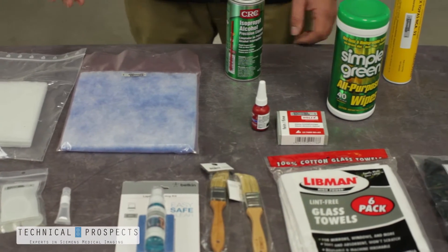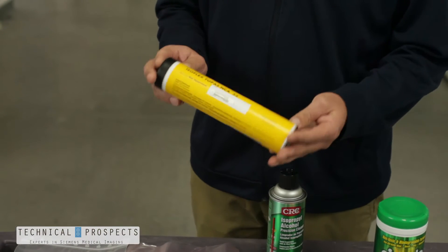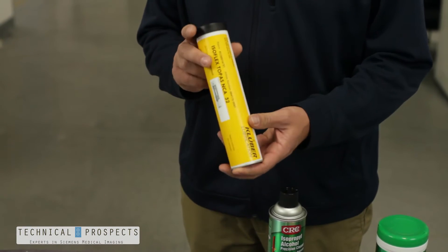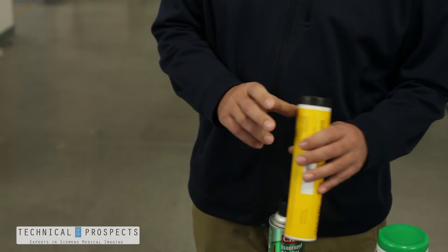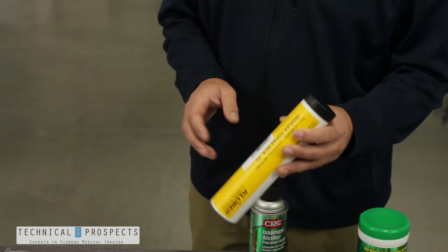Some of the key items that are included is a tube of grease. This grease is for lubricating your gantry. We also have available the grease guns that would be used to apply this to your system.